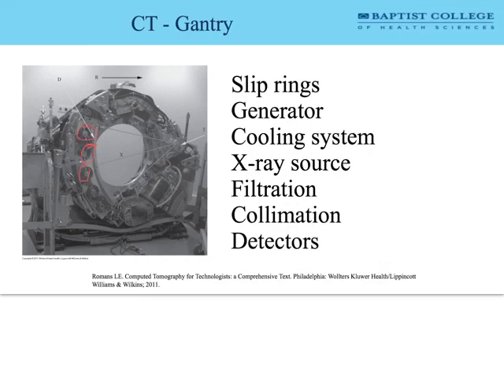But sometimes there's also things like oil that is helping cool certain parts of the x-ray tube. You don't need to know all the ins and outs of how the cooling system works. Just understand that it has a pretty important cooling system, and it has an important role in x-ray production.